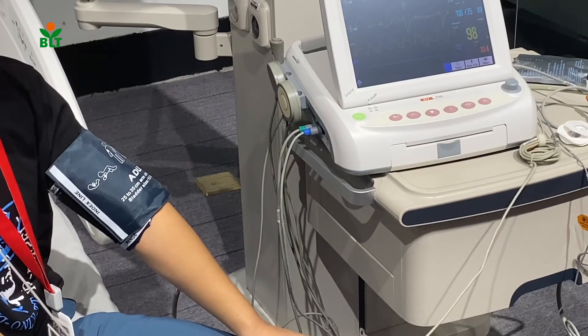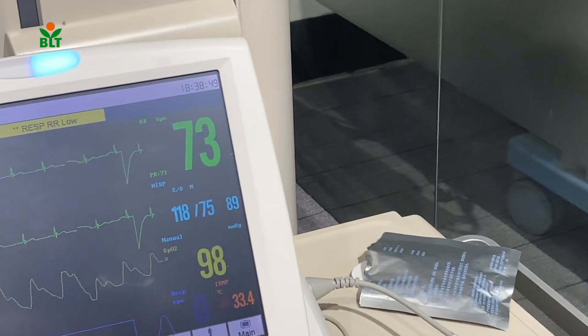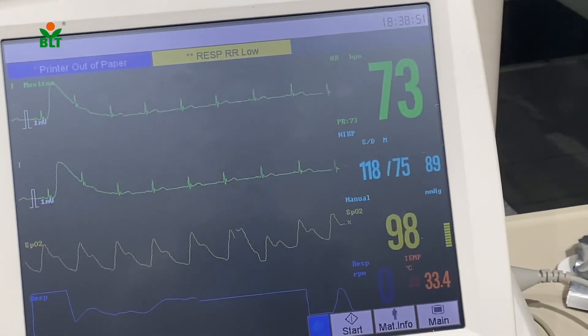This is the 5-lead ECG. Once I apply the ECG leads onto the patient body, I am able to see the waveforms on screen straight away.